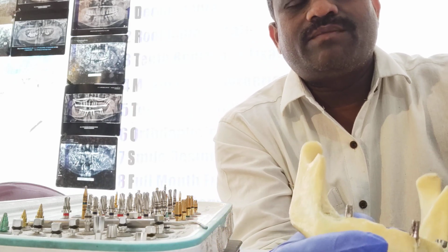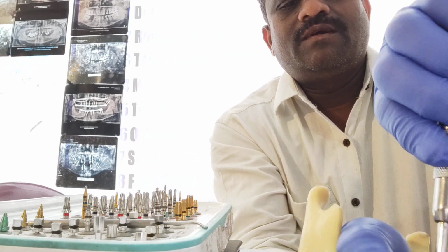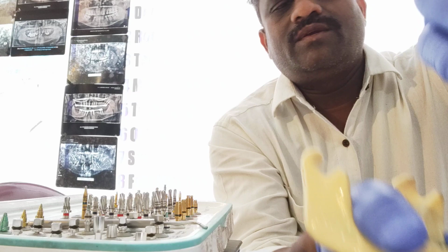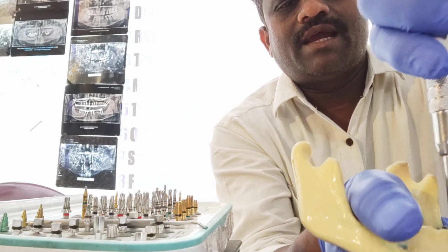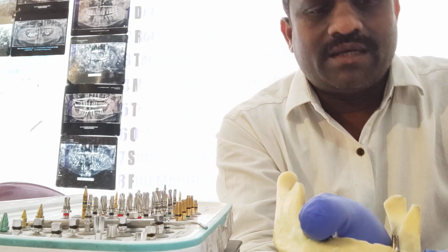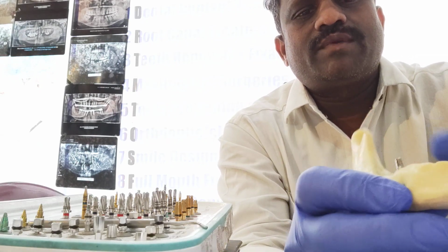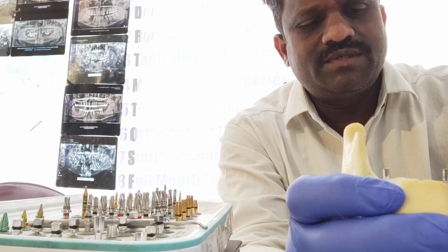So you can bend this implant also if needed. For the prosthetic purpose, you can bend this implant. You can bend this. So your implant bending should be such that the implant should not lose its stability and anchorage. So in that way, you are going to place the implant in the anterior mandible.